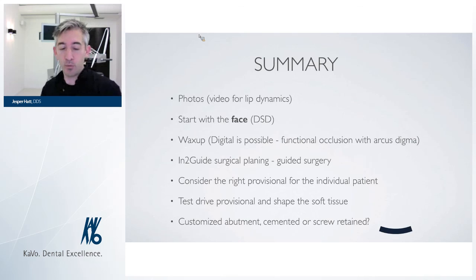And to support it all, we use customized abutments: cemented, screw retained, occlusal screws, horizontal screws. Well, it depends on where in the mouth and on what patient.